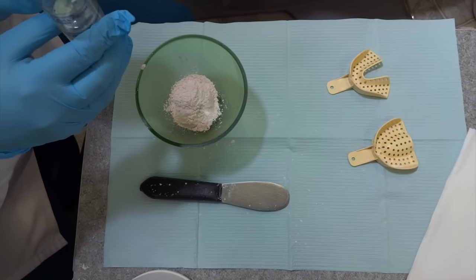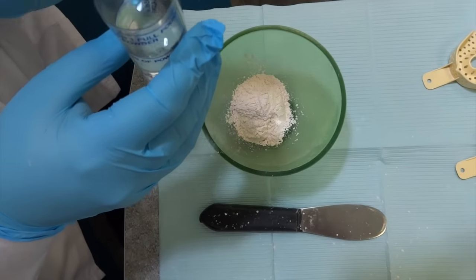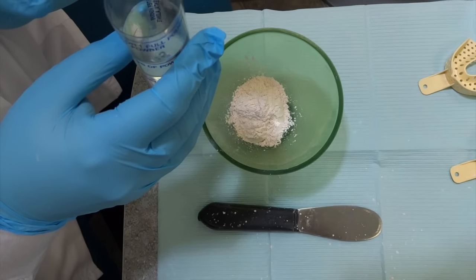Make sure you have your water correct for how many scoops and use the water container. A lot of people don't use it, but I always recommend using it.